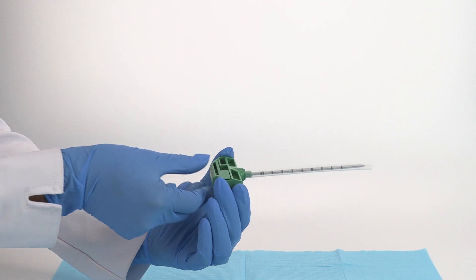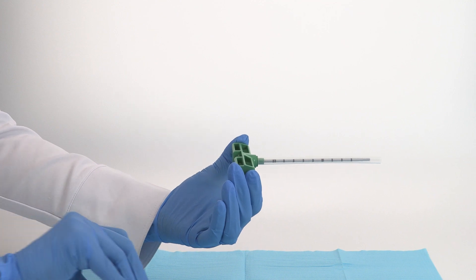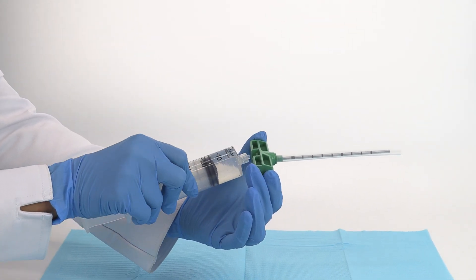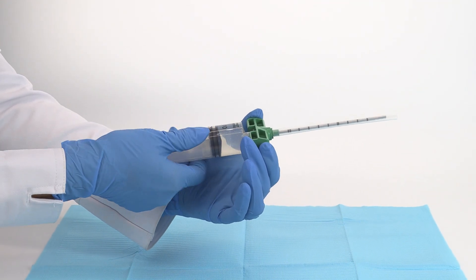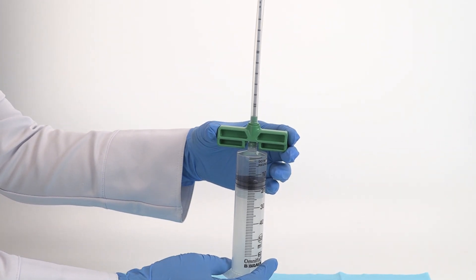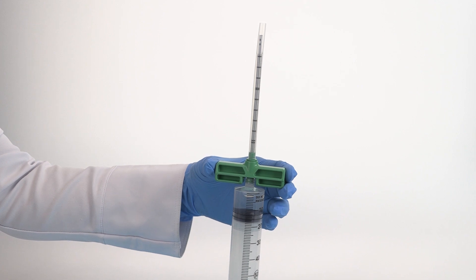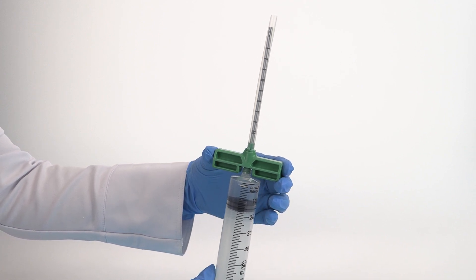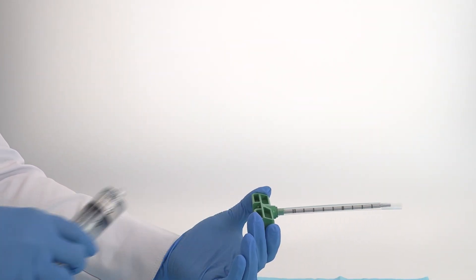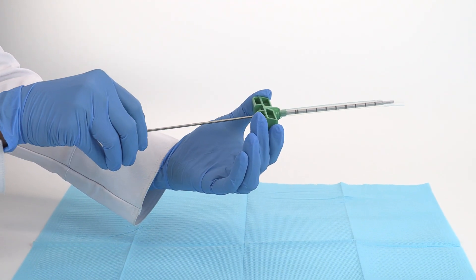Remove the stylet from the bone marrow needle and prime the needle. Then reinsert the stylet.